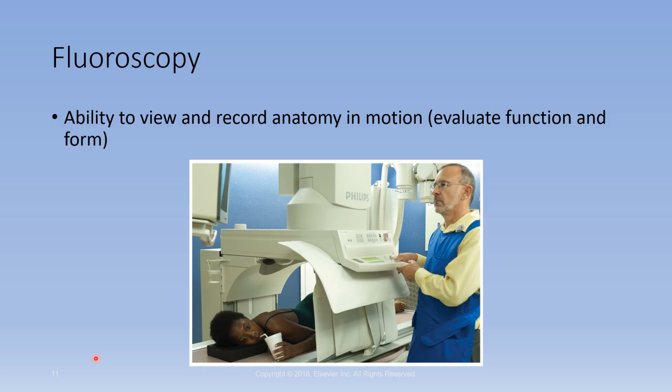That helps us to evaluate the function and the form of the anatomy that we're looking at, because you're looking at it live in motion, versus when we take our overhead images, those tend to be still pictures that capture one moment in time, whereas this could be recorded, and then the radiologist could play that back to actually look at and evaluate what is going on with that patient.